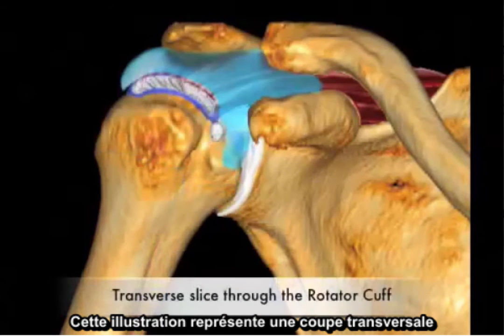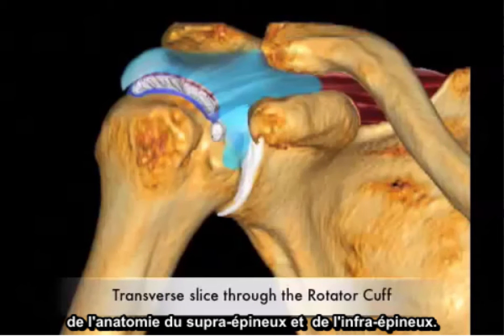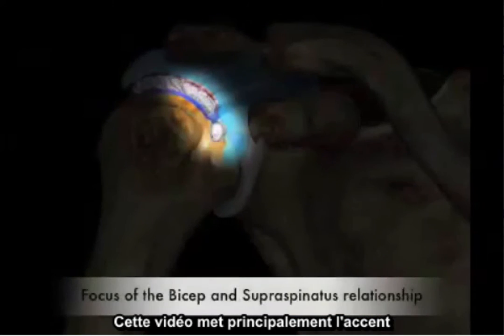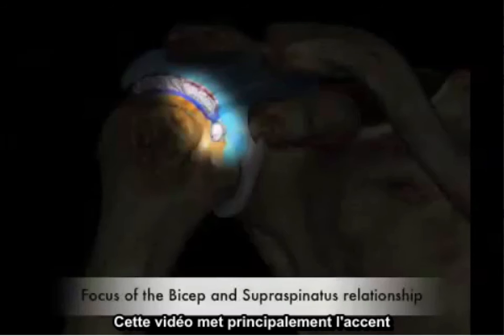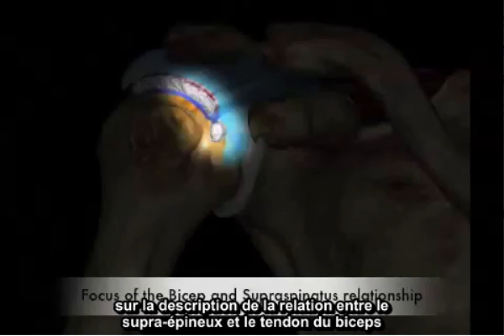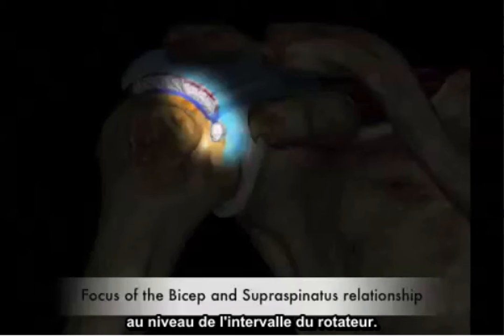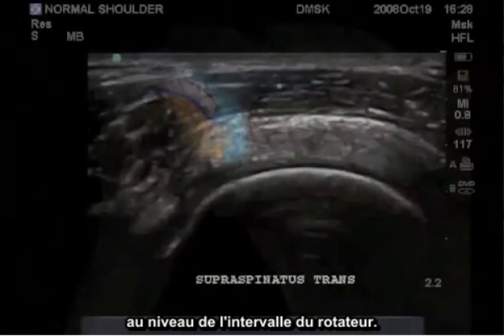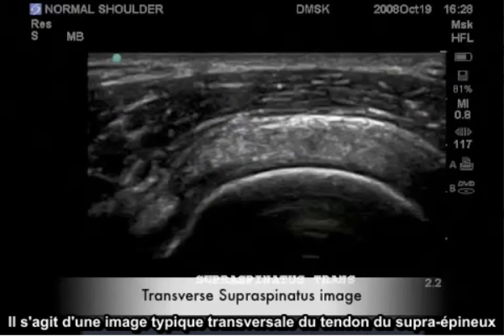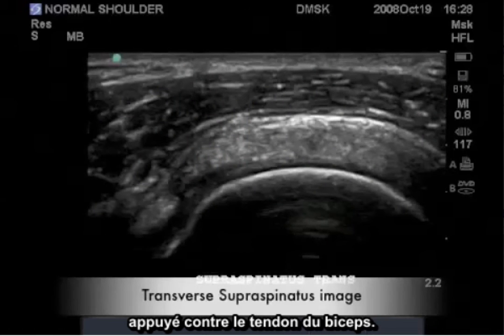This illustration represents a transverse slice through the anatomy of the supraspinatus and infraspinatus. The main emphasis of this video will be to describe the relationship of the supraspinatus and bicep tendon at the level of the rotator interval. This is a typical transverse image of the supraspinatus tendon resting near the bicep tendon.